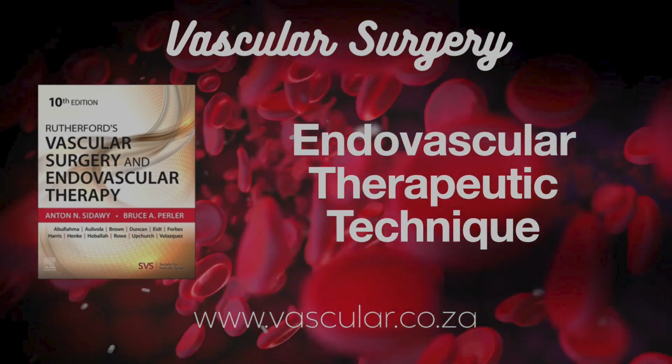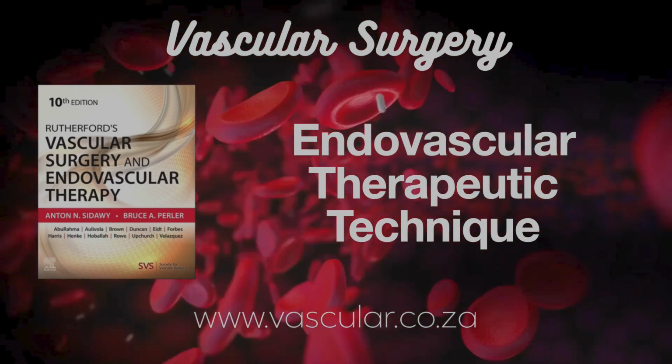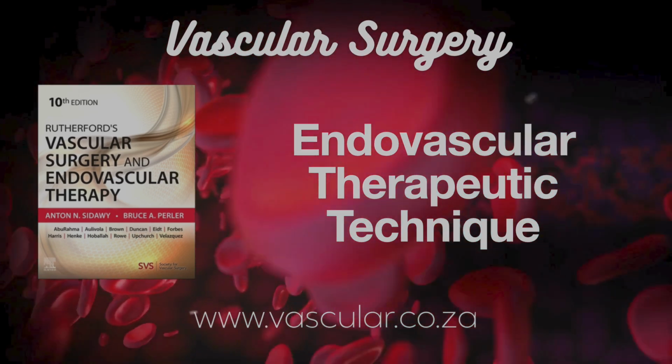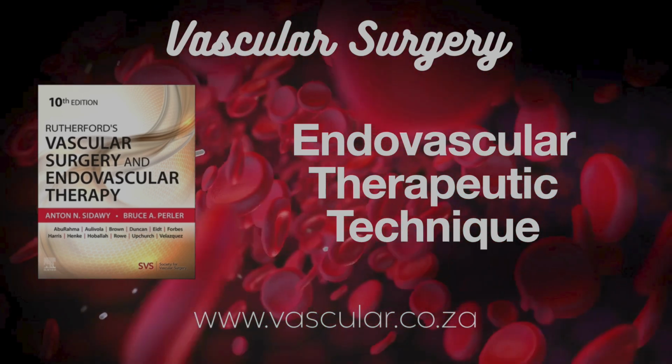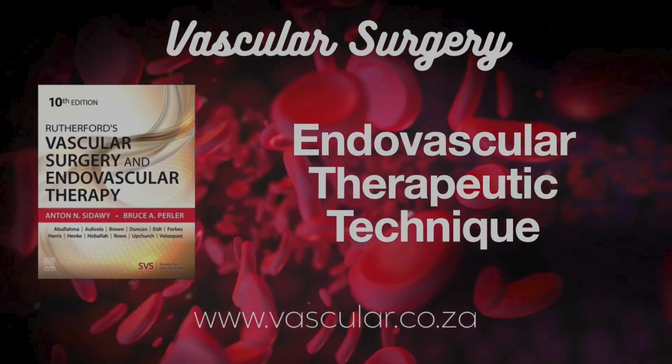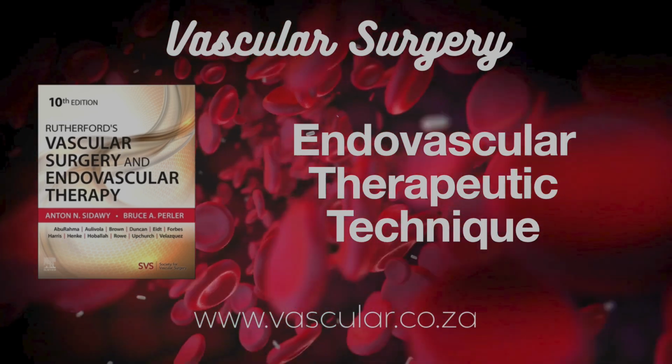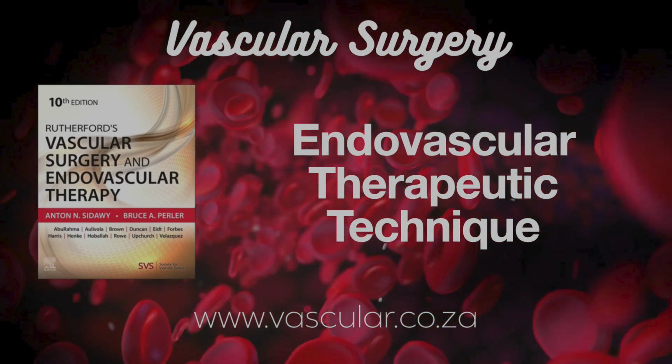Exactly. Catheter-directed thrombolysis works but carries risks of bleeding, clot fragments breaking off and traveling downstream, embolization, and the clot coming back. So mechanical thrombectomy devices were developed to try and reduce those risks and remove clot more efficiently. The source mentions aspiration thrombectomy first. Sounds simple, just suctioning the clot.